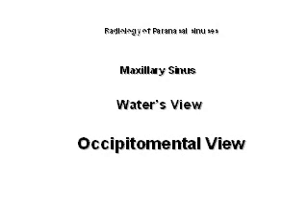Radiology of the paranasal sinuses. To study the maxillary sinus, the best view is the Waters view, also called the occipitomental view. The patient should be seated facing the plane of the film upright. The mid-sagittal plane should be perpendicular to the plane of the film.